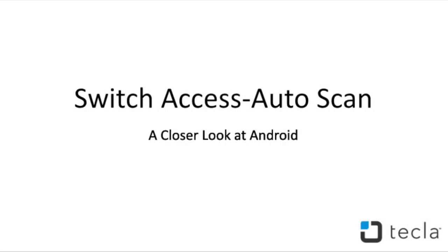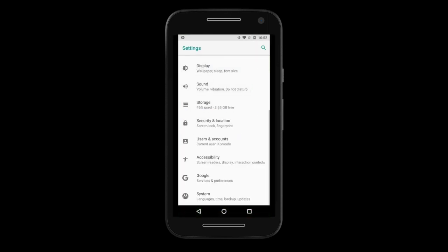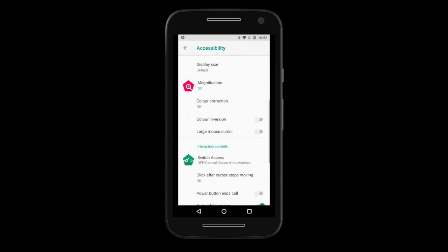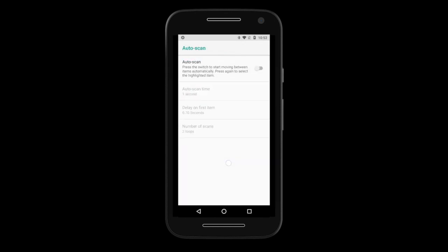You are now ready to set up Switch Access with your Tecla E. To begin with Autoscan, go to Settings, Accessibility, Switch Access, then go to Switch Access Settings. To turn Autoscan on, tap Autoscan and enable it in the next screen. Here you can adjust the scanning rate — default is 1 second, which may be too fast for a first-time user. You can also add a delay on the first item of the screen, and set the number of loops that the screen will be scanned before Switch Access hides.